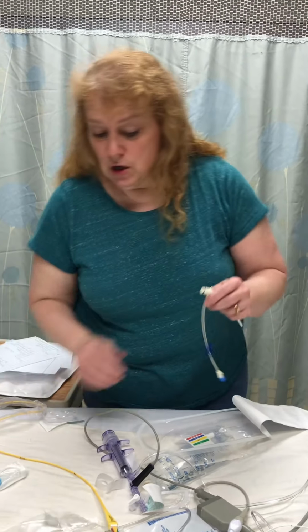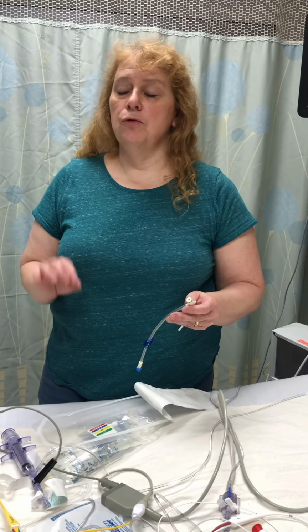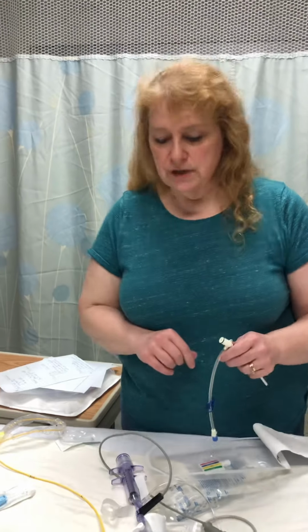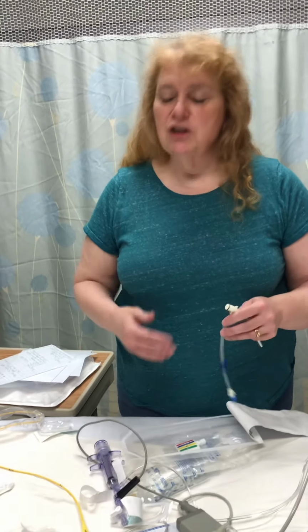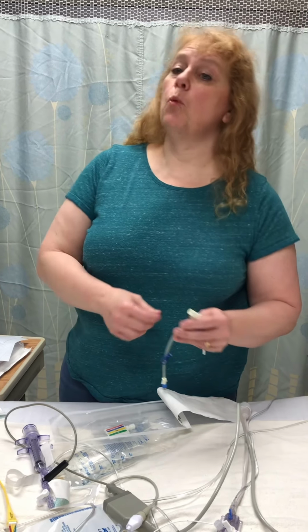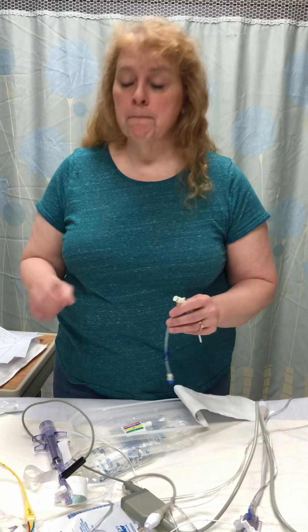We have extra of these in the supply room, but whenever a swan is inserted, this should come with the kit. So once you have the order, you want to make sure you check the x-ray, make sure that there's no weird little kinks or knots in the pulmonary artery catheter before you take it out. But basically, you're going to take it out like you do any other central line. You're going to have the patient as flat as they can be. You're going to practice taking a deep breath and holding it while you withdraw it slowly.